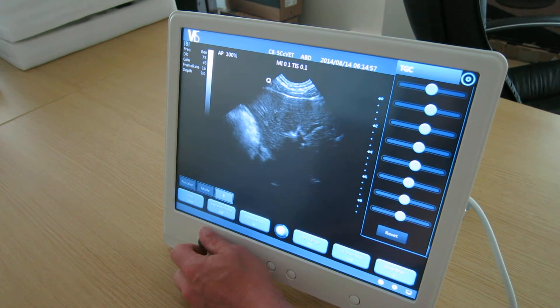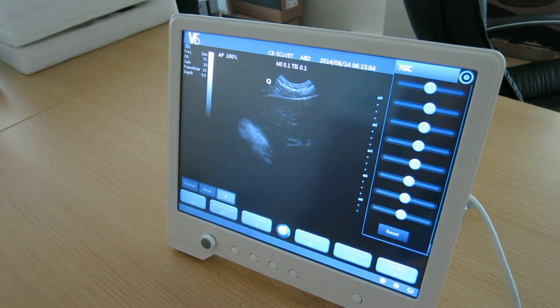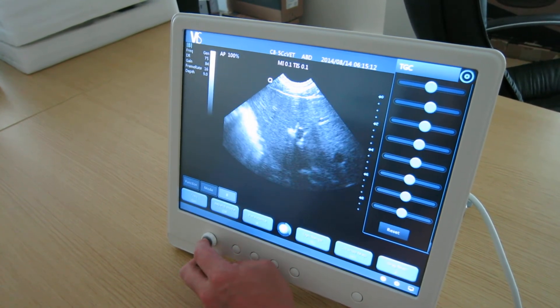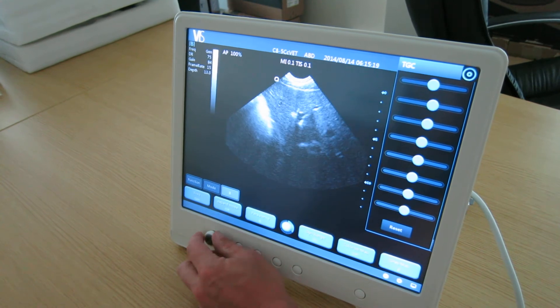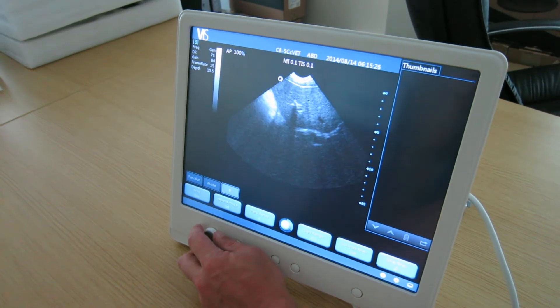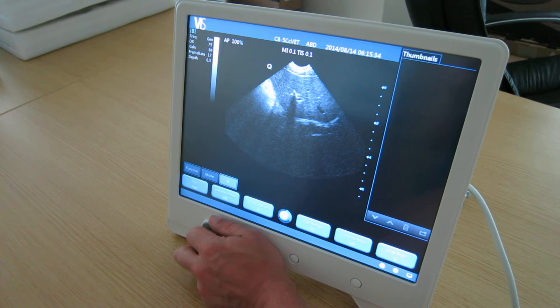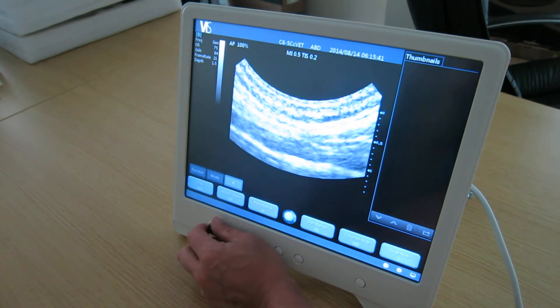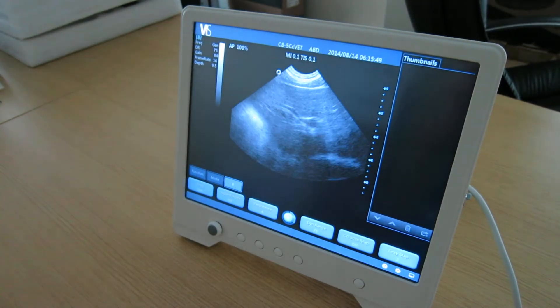I'll turn that down a bit. So it has good gain range, good penetration, good depth range. Just need to press the button once and then you change the depth — down to 15cm going all the way down to 1.5cm. Ideally, we're scanning probably around the 9cm mark for today's demonstration.